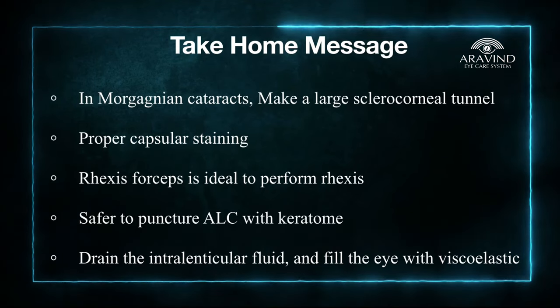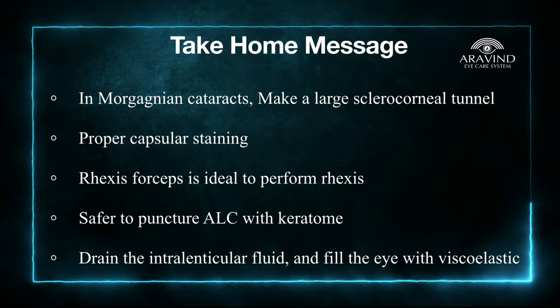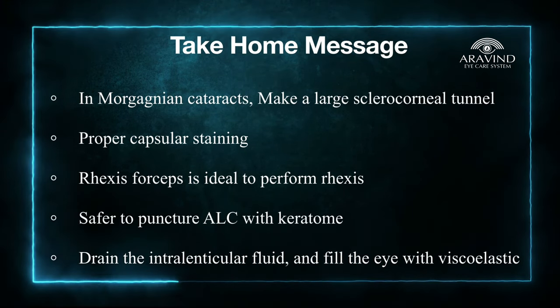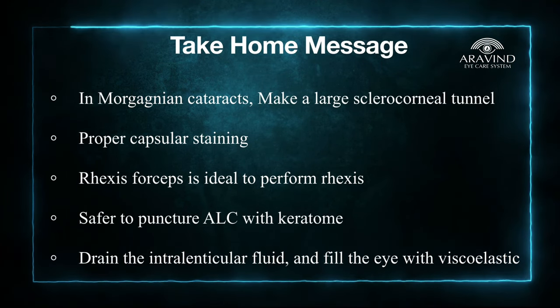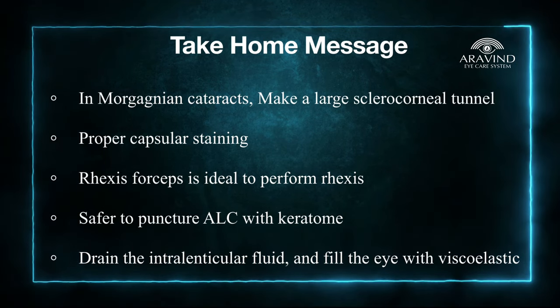To summarize, while operating on Morgagnian cataracts, always make a large sclerocorneal tunnel so as to facilitate the nucleus removal. Proper capsular staining is very important before initiating rhexis. Rhexis forceps is the most preferred instrument in such cases. It's safer to puncture the anterior lens capsule with your keratome.